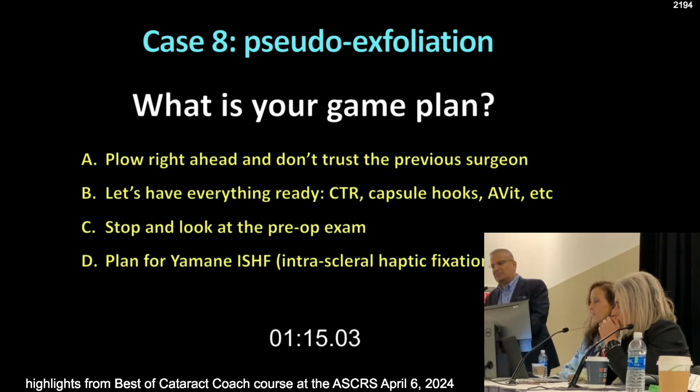Plow right ahead, don't trust the previous surgeon? Let's have everything ready. CTR, capsular hooks, AVIT. Stop and look at the pre-op exam, or plan for Yamane.